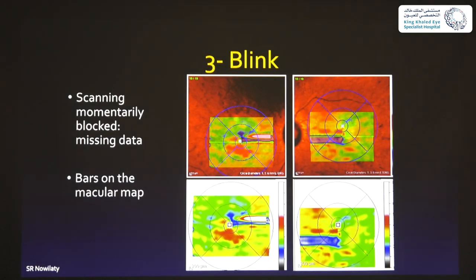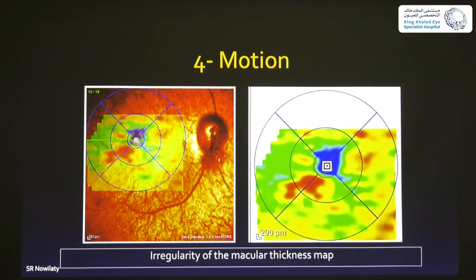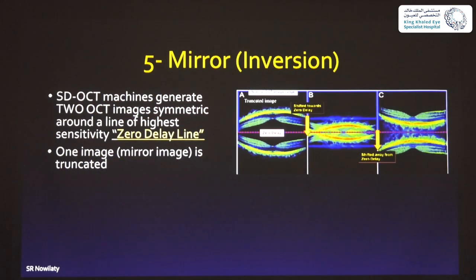Blink artifacts cannot be corrected — the patient has blinked. You recognize them by shadows and lines in the scan, in which the machine made a very wrong segmentation, showing as a very large thickness or a hyper-reflective area. Motion artifacts appear as horizontal lines across the image, similarly producing irregular maps. Mirror artifacts occur every time you have a lesion protruding towards the vitreous, or in patients with myopia and posterior staphyloma where the eye wall is irregular — the machine cannot focus both on the intended area and the irregular area simultaneously.